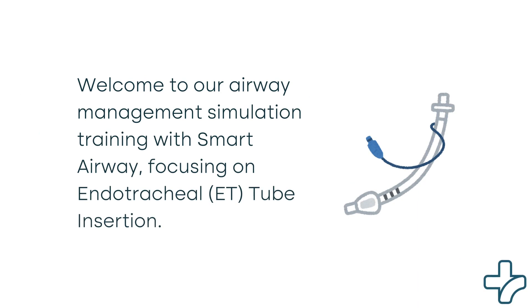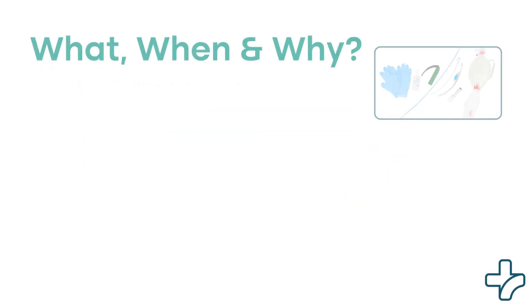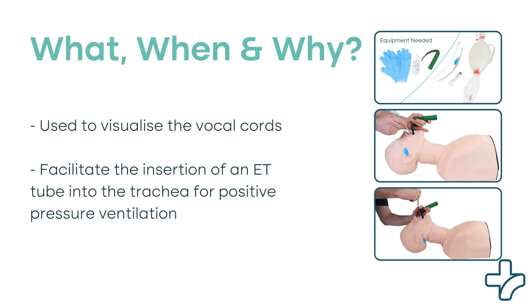Welcome to our airway management simulation training with Smart Airway, focusing on endotracheal tube insertion using direct laryngoscopy. Direct laryngoscopy is a technique used to visualize the vocal cords and facilitate the insertion of an ET tube into the trachea for positive pressure ventilation.